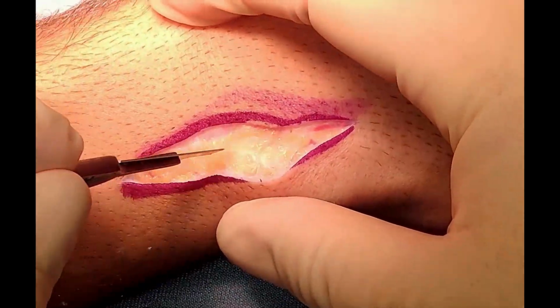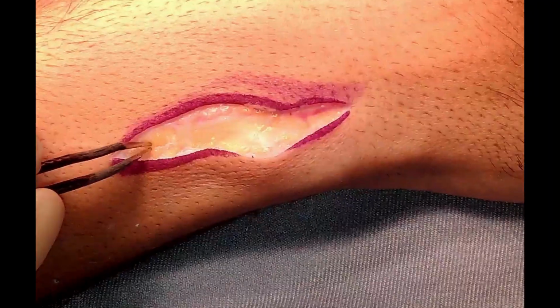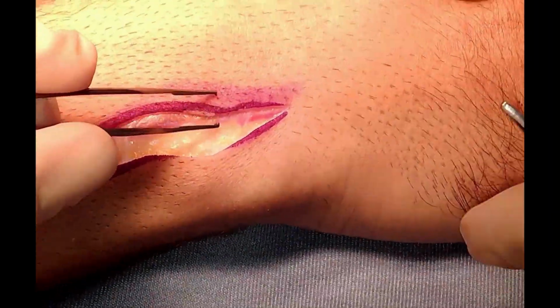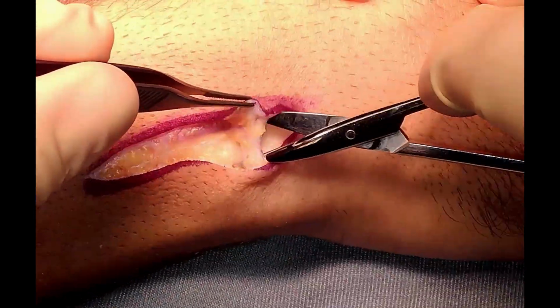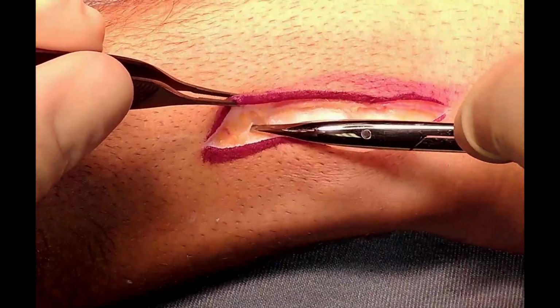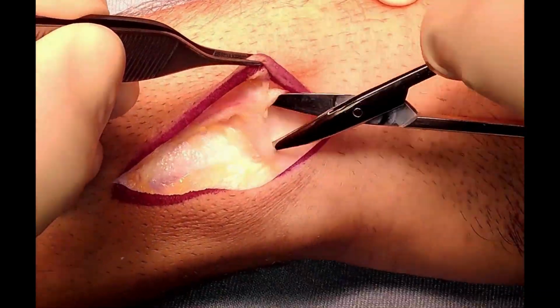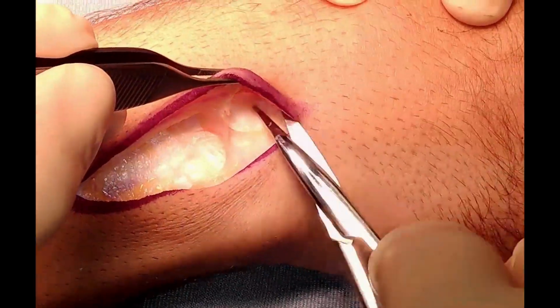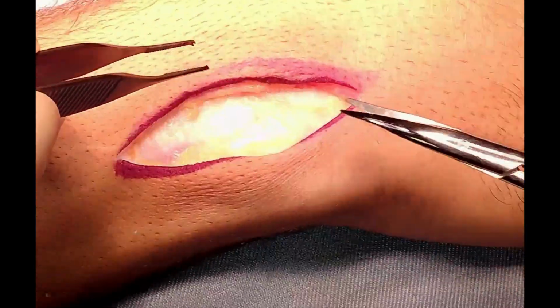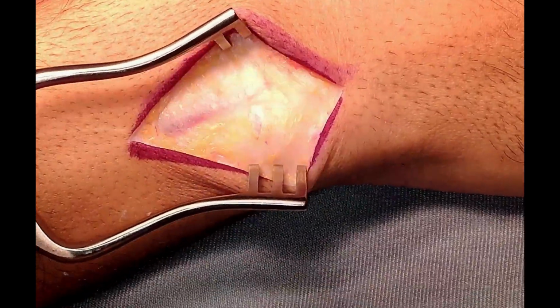We start by skin incision, followed by hemostasis with the help of a bipolar and gentle dissection to take away the sensory radial branches of the SRN and the dorsal ulnar branch of the ulnar nerve away from our surgical field. And as we dive in deeply, we will encounter the fifth compartment. We will be opening it and taking away the EDM radially and excising the ganglion.